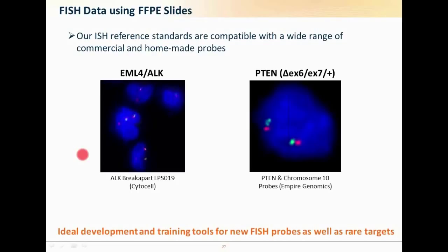We found that you can optimize every single probe, but technically you have to optimize your assay to make sure those probes are working.